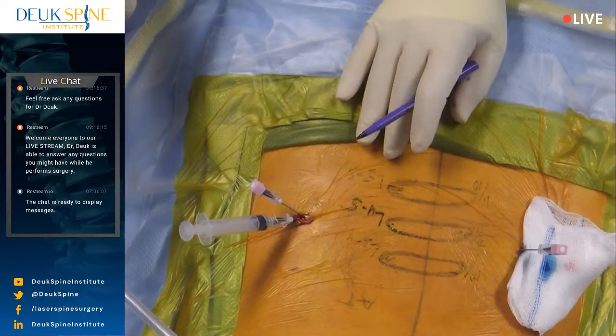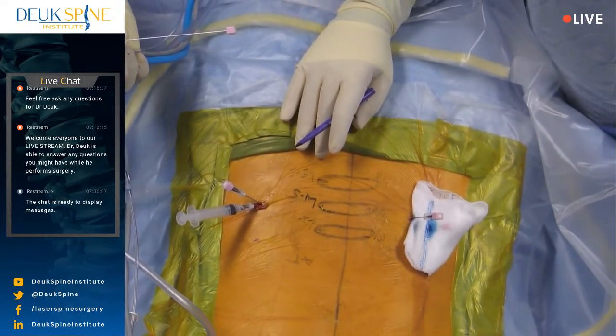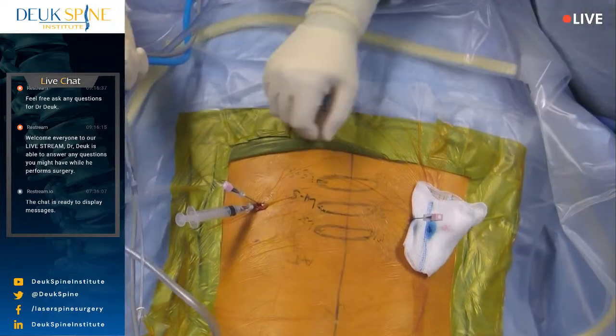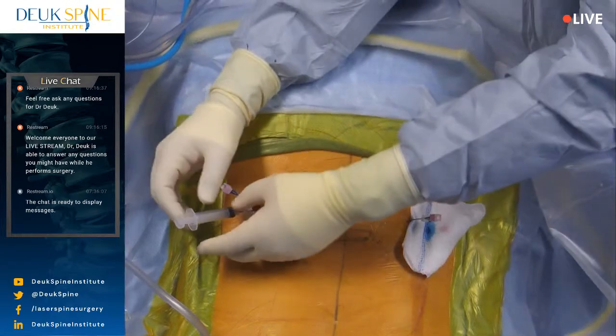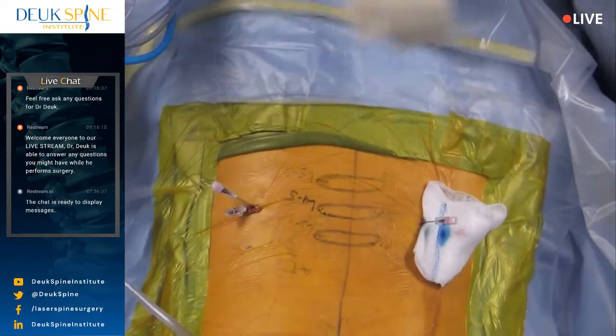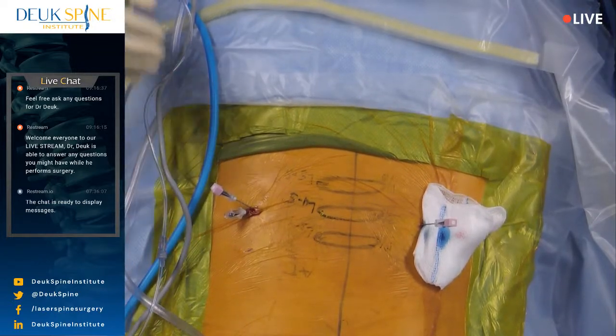Good news, you get to go to sleep now. When you wake up, your surgery will be over. And that pain will be gone. All right. Can you count from 1 to 100 out loud for us, please? So while our patient is counting out loud, the anesthesiologist will put the patient to sleep.